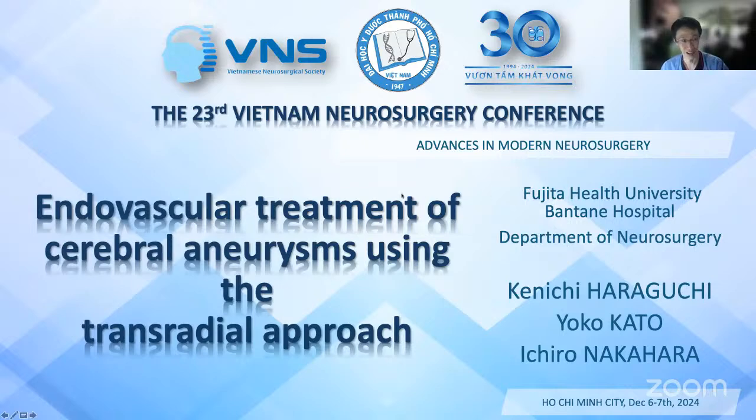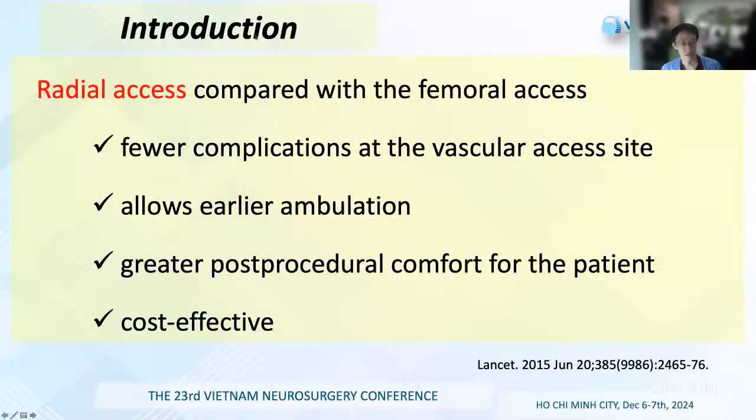Okay, so this is the introduction. The largest advantage of the transradial approach is fewer complications at the puncture site. It also allows early ambulation, the patient is comfortable after the procedure, and it's cost effective.